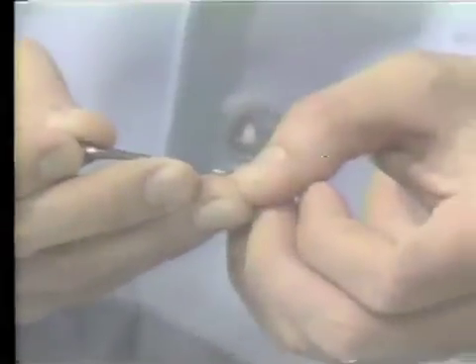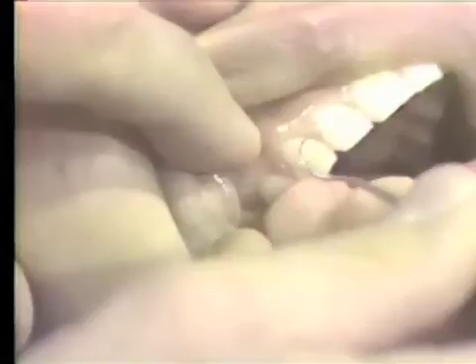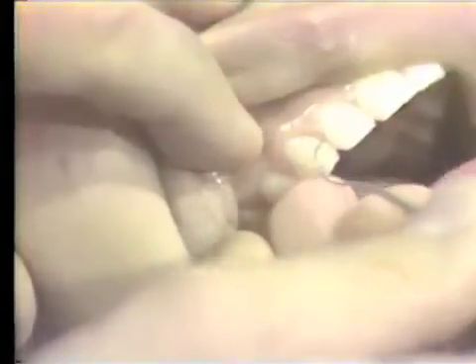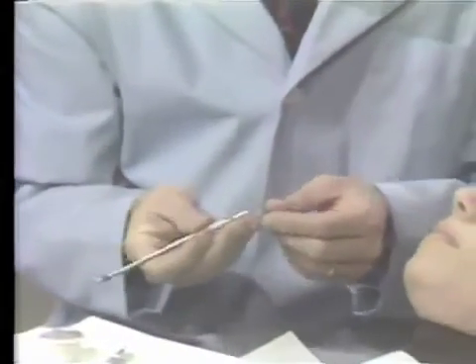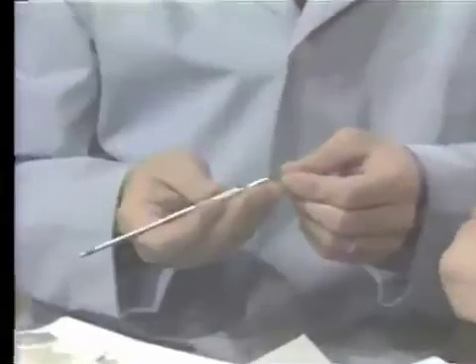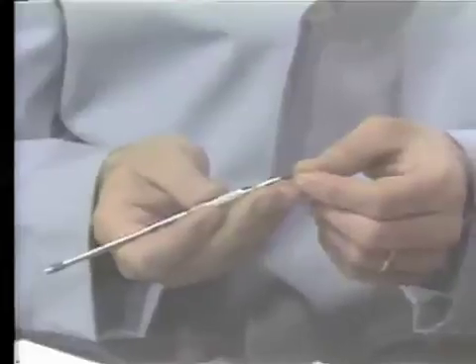Now let me go to the mouth and demonstrate the same motion. Remember that the tip of the explorer has to be next to the surface of the tooth, and that we are moving the explorer subgingivally to the base of the sulcus. Sometimes there is confusion between using an exploring stroke with an explorer and an exploring stroke with a scaler. An exploring stroke with a scaler is used to make sure that the scaler enters the pocket and extends to the base of the sulcus.